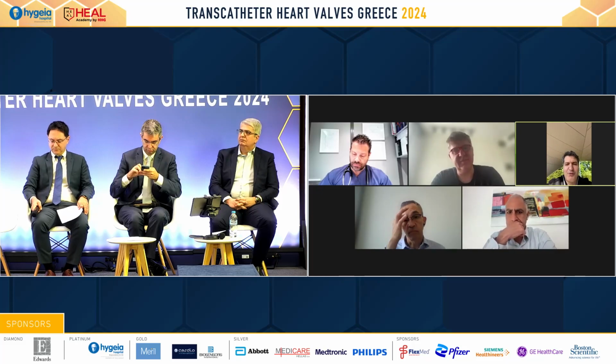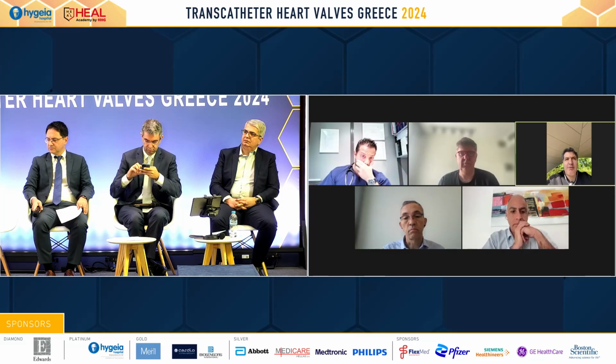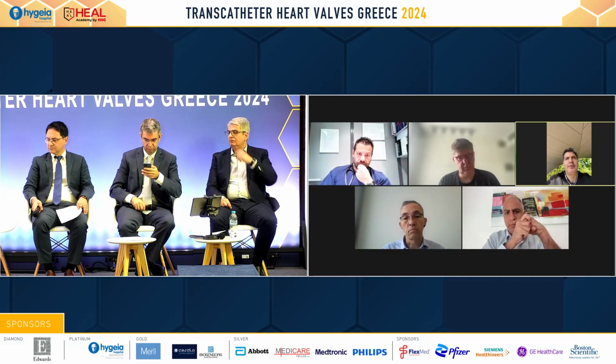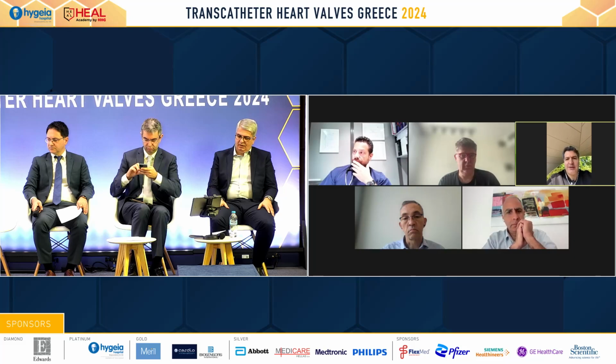Thank you for the kind invitation again, and for your questions. For the first question with regard to the ring, I'm using nowadays predominantly bands. The reason for that is, as you know, there is no annulus at the level of the aortomitral curtain.